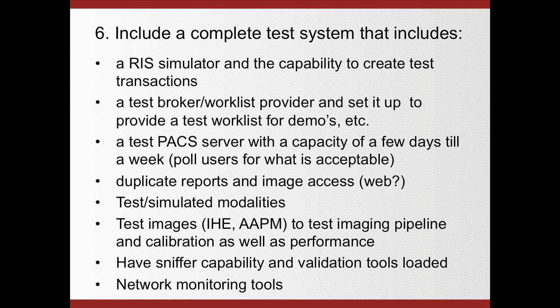Another important component of a test system would be the capability to duplicate reports, also having alternate image access. For example, let's say the PACS might go down for whatever reason. There might be a hardware issue, and if in addition there's always a copy of the images on the web server, and then a user can always go to any PC and log in via some kind of web access and still have access to the images, that would be a good backup strategy as well.